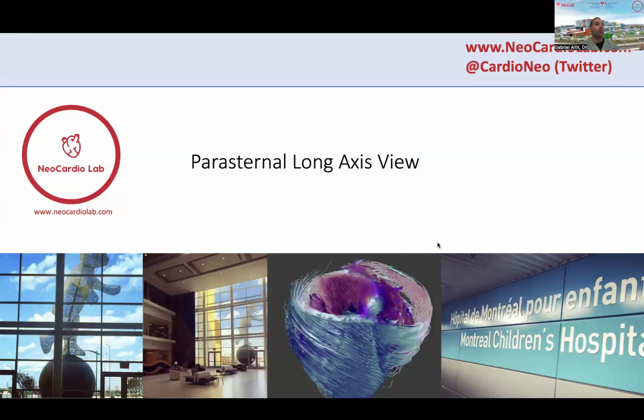But let's say that you're actually the first one scanning and then your images will eventually be reviewed, or that you're later on going to get a structural scan by cardiology, then you probably also want to include all these views to make sure you're not missing something. There are also sometimes lesions that will appear later in the course of patients.